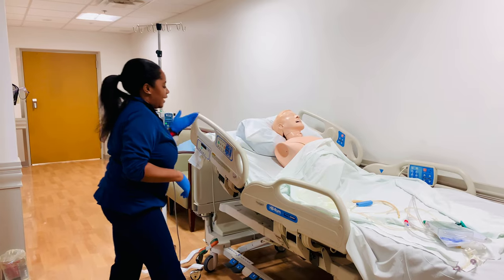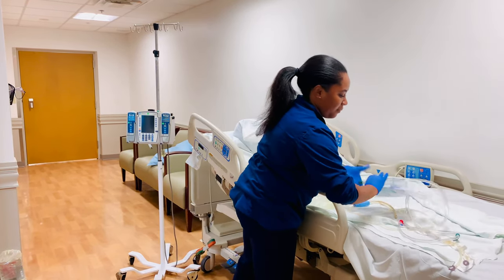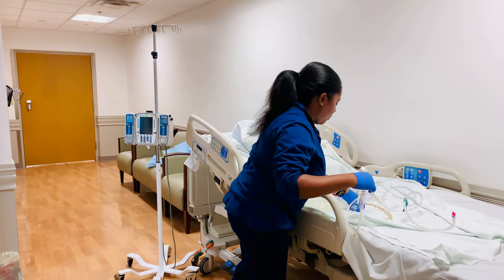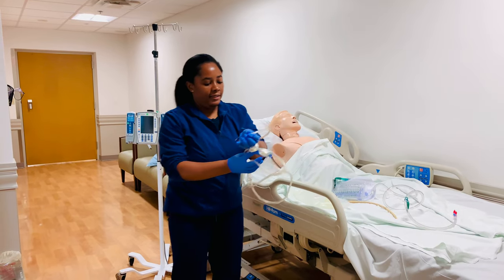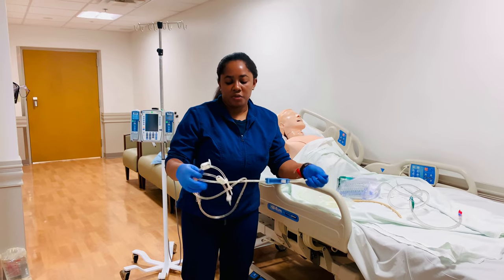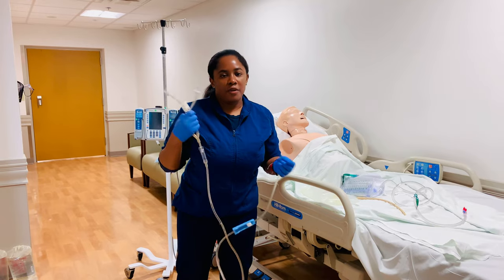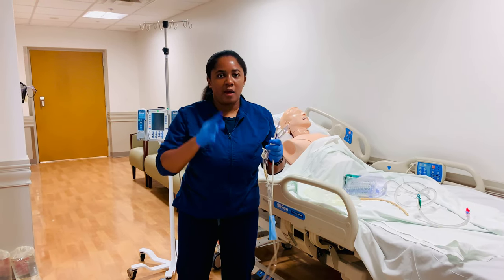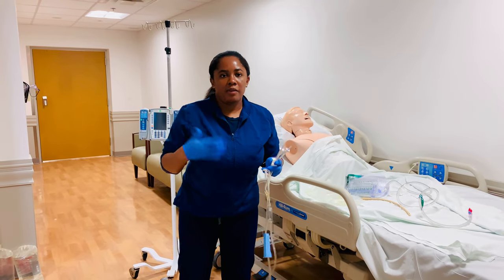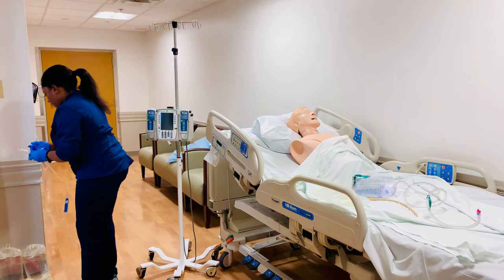I've already identified my patient, so I'm going to grab my line. Usually the lines come separately in your essential supply. It comes with a two-connector so you are able to connect two bags at a time, but any time you're hanging those two bags, you always want to make sure only one is running at once — you don't want to be irrigating with two bags at the same time.